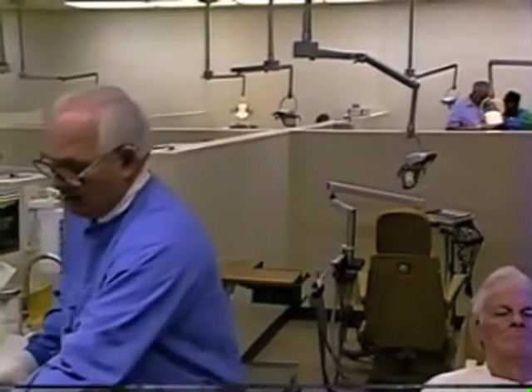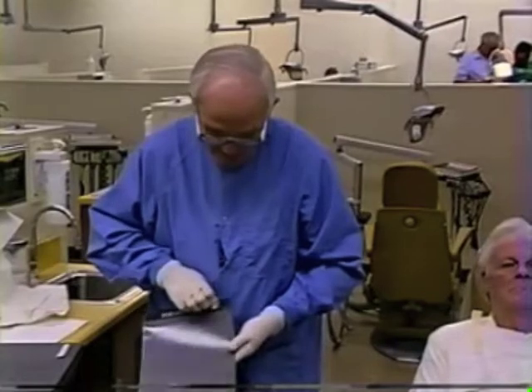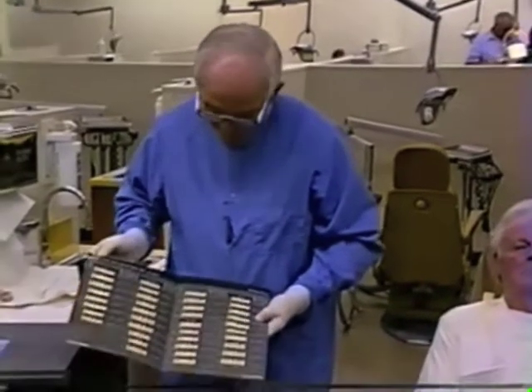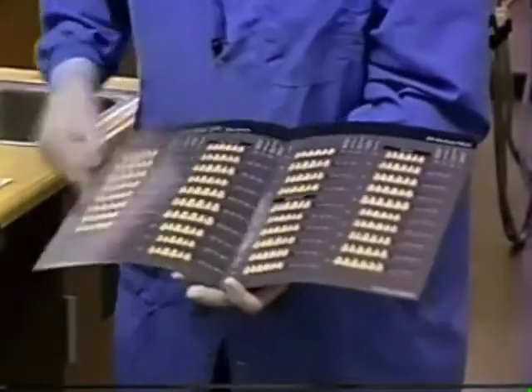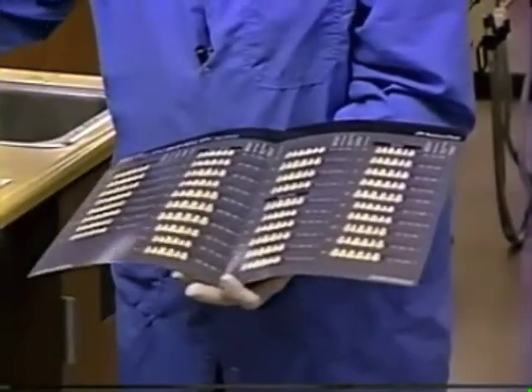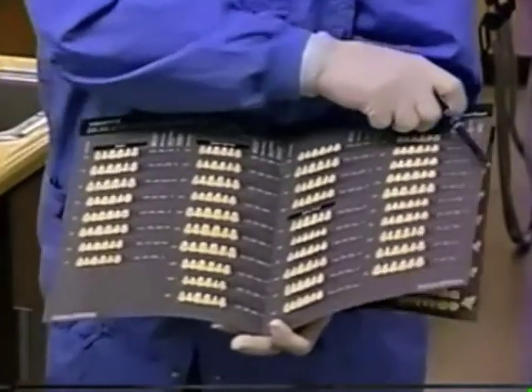We take that information — seven and three-quarters to eight millimeters wide for a central incisor and a square tapering face — and go to the tooth catalog from the supply company. We look for teeth that fit that category. The teeth are shown as square, square tapering, square ovoid, and tapering.